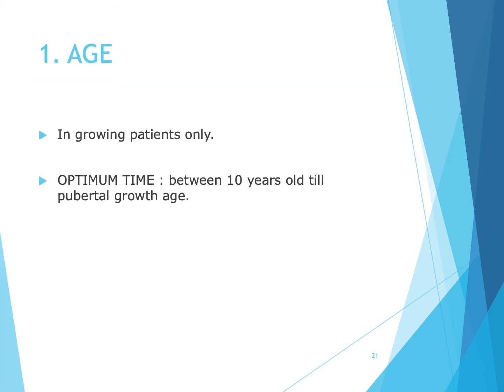For age, the growth modification therapy using functional appliances is possible only in a growing patient. The optimum time for myofunctional therapy, according to most authors, is between 10 years of age and the pubertal growth phase.